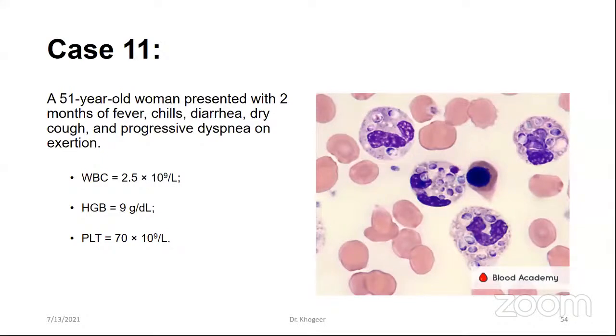What is the significance of finding toxic granulation in a normal, non-septic individual? Usually toxic granulation mainly correlates with infection and inflammatory process, and the degree of increased granulation, how dense and dark it is, also correlates with the viral load or the bacterial load in the body.